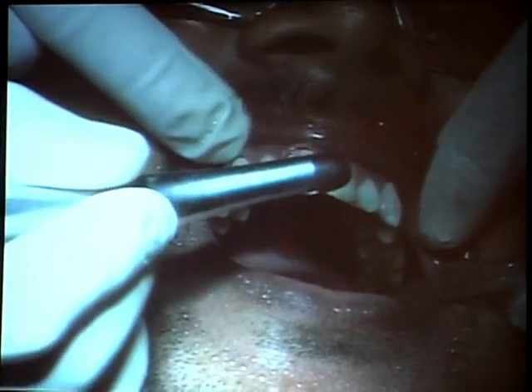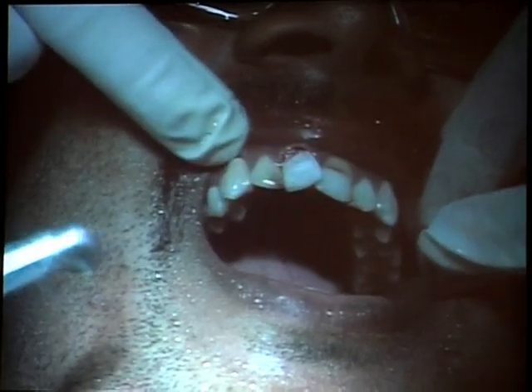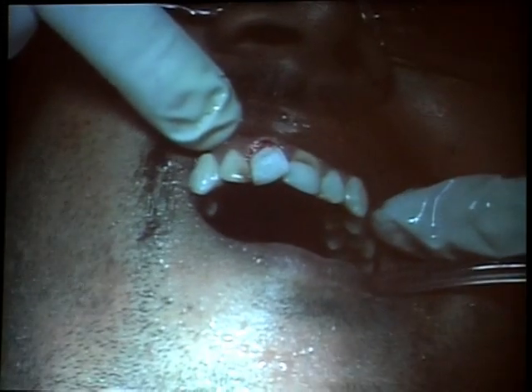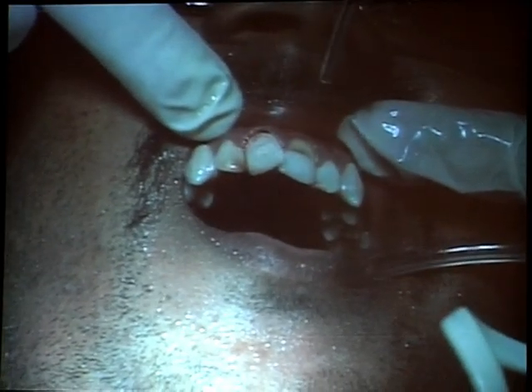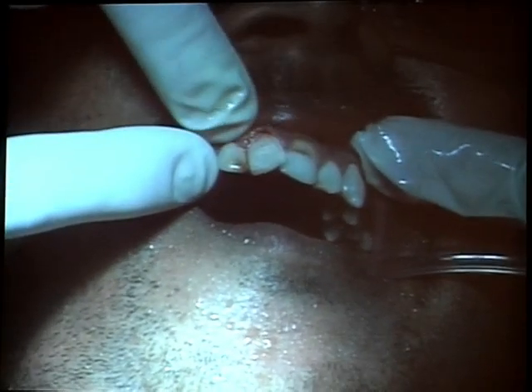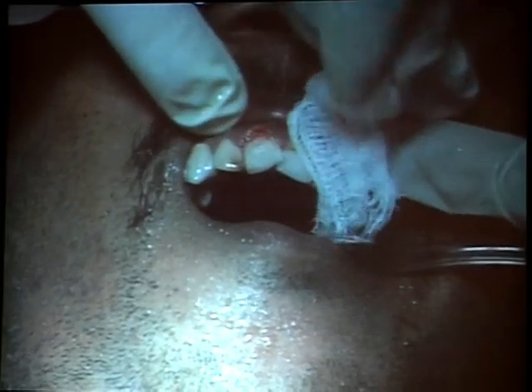So I don't think you can see the step I've created. Yes, we can see the margin. On the side, I think with the camera, it's not clear to see. I think you can see it though. It's very accurate, the margin you can make with this. And you can see I've never hit the gingiva, otherwise you would see white spots on it. So you can aim very, very well with this device.